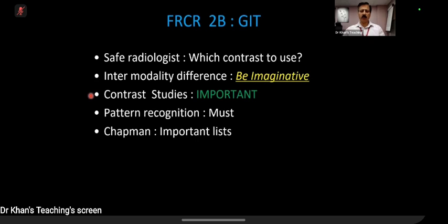Wherever I go in the world, I ask everybody, and contrast studies, for obvious reasons, have gone down. So it's a weak link for you, and the examiners know it. So still contrast studies are asked in the exam, and I am going to show you a lot of contrast studies intentionally. You are very good in CT, but you are not good in contrast, so I will concentrate there.